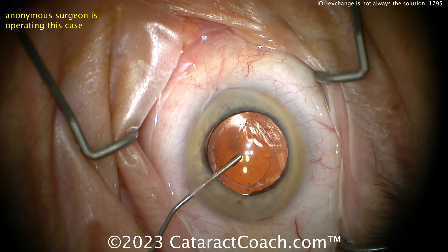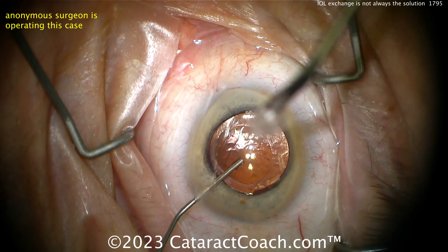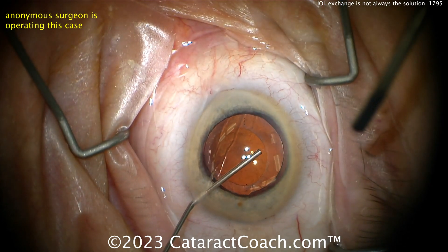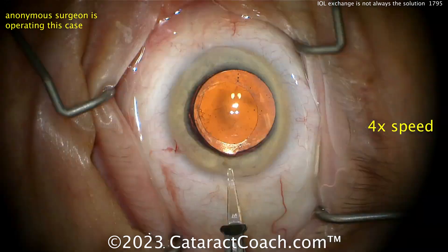The surgery was done a while ago and there's capsule contraction. Making a couple pairs of relaxing incisions, filling the eye with some dispersive viscoelastic, maybe trying to get underneath that rhexis edge. You can see there's a little contraction on that capsular rhexis. Looks like a Vivity extended depth of focus lens with toric marks on it.